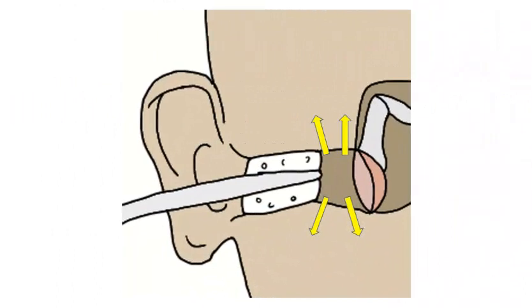The risk of overmasking then is determined by assessing the interplay between the intensity level of the masking noise, our working interaural attenuation value, and the cochlear hearing of the test ear.